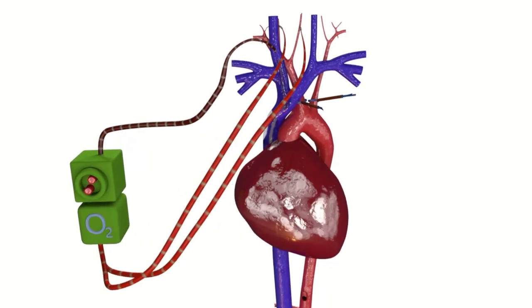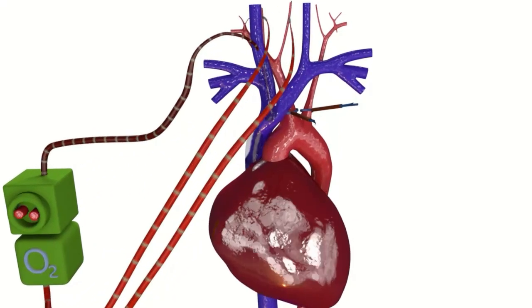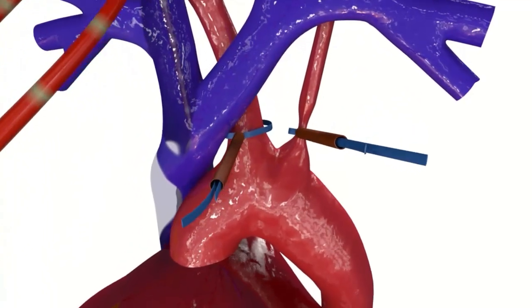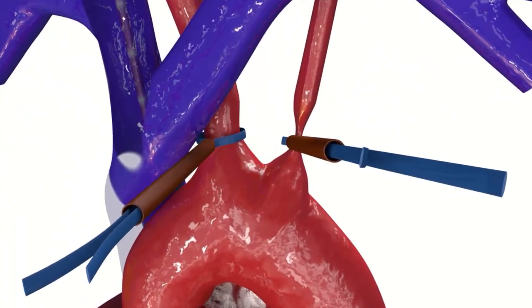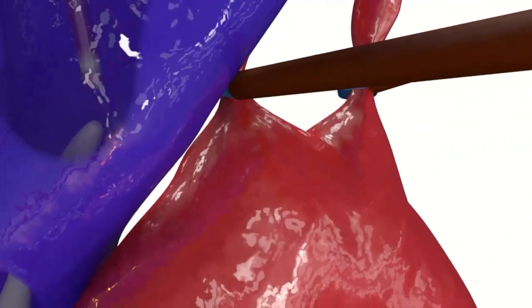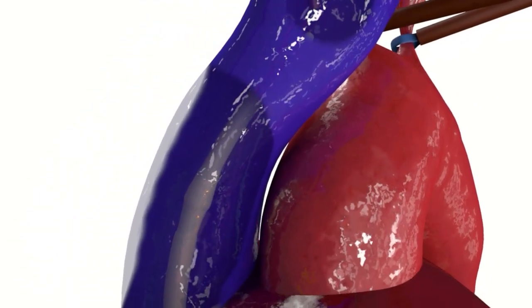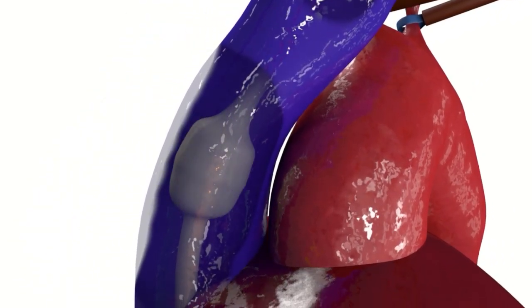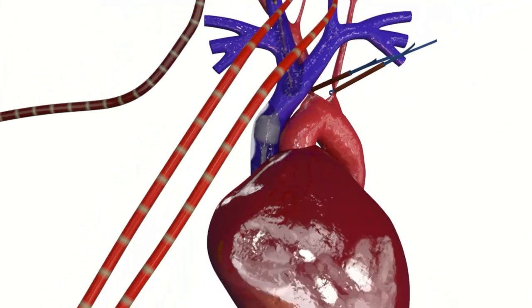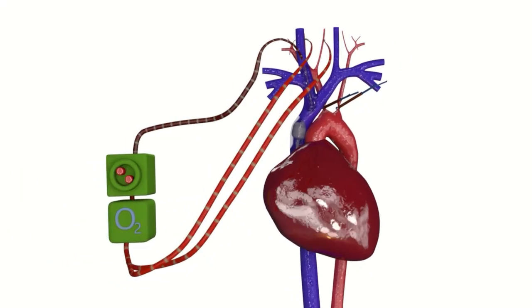Initially, it operates in a parallel circulation mode, where the upper body's circulation remains connected to the natural cardiac output. The cardiovascular system is allowed to adapt, and the medical team ensures the stability of hemodynamics and vital monitoring parameters. Subsequently, vascular bands are sequentially tightened on the right and left branches of the aortic arch. The balloon catheter in the superior vena cava is then inflated. At this stage, natural and artificial circulations are separated, and the head is perfused exclusively via the cardiopulmonary bypass circuit.